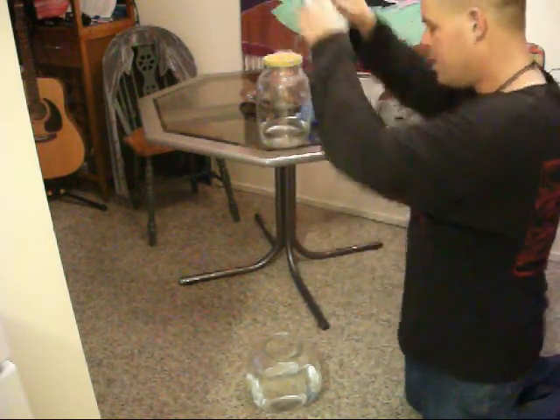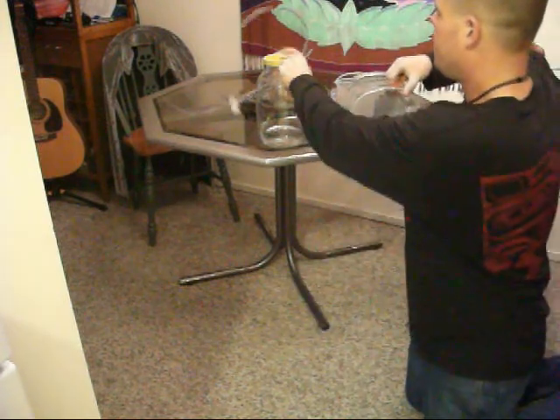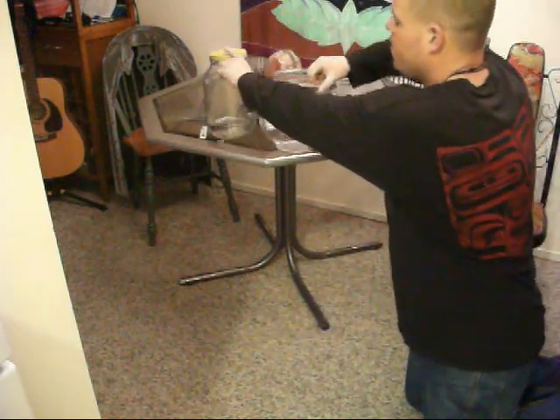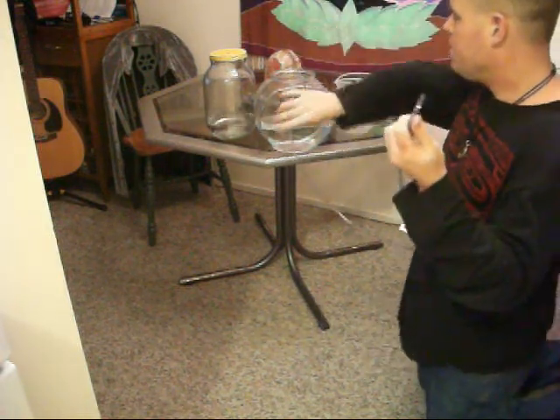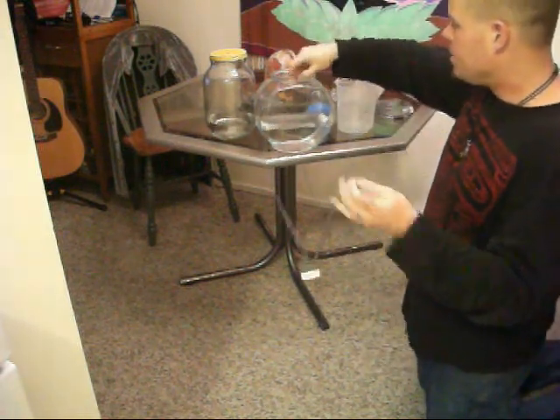You could use a fish tank if you have one, or you can get them at thrift stores as well, if you want to do the cheap version. And you can just stick that in there.